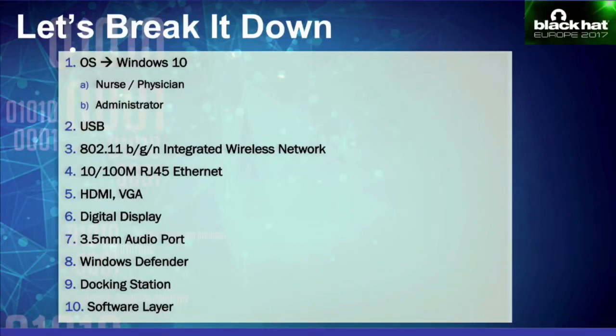It had the capability to connect over wireless and Ethernet. It had an HDMI/VGA port for display, a digital display itself, and an audio port. It came with Windows Defender, fully updated. It had a docking station to dock the pen, and the software layer itself. There were some manufacturer applications, the digital pen applications and services, that we saw running on these devices.